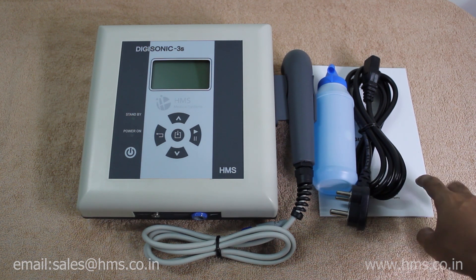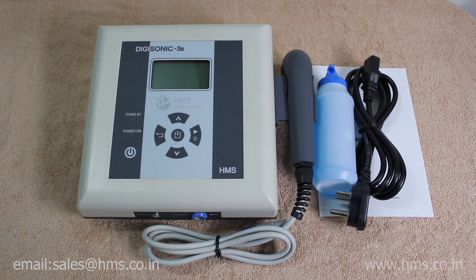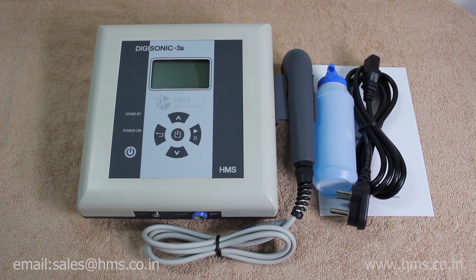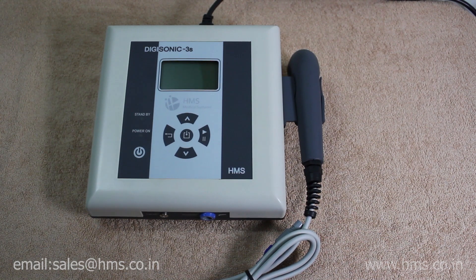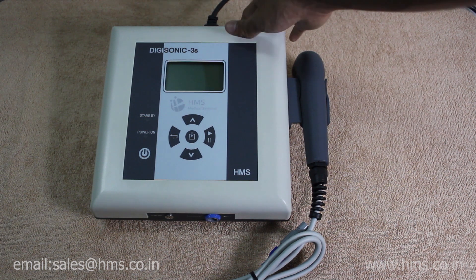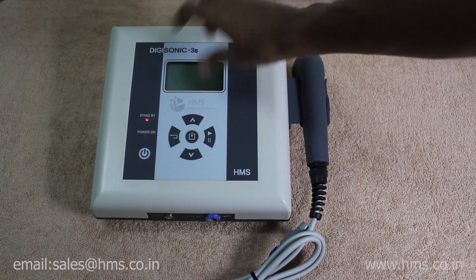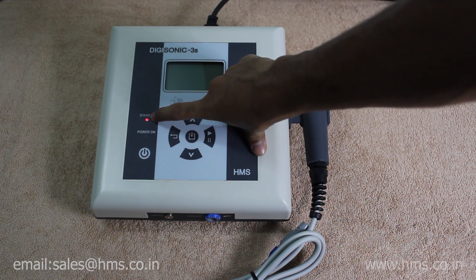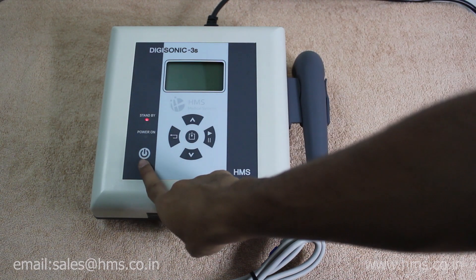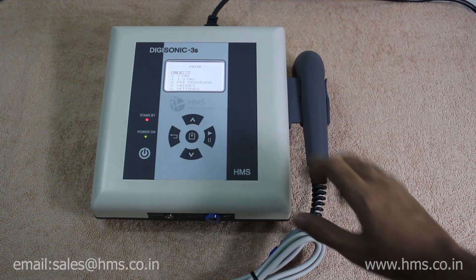Now let's get to the machine itself and its working. Switching on the machine is very simple — you just have to plug in the power cable to the back of the machine. There is a power button here; switch it on, the standby light will light up, and the machine gets started.